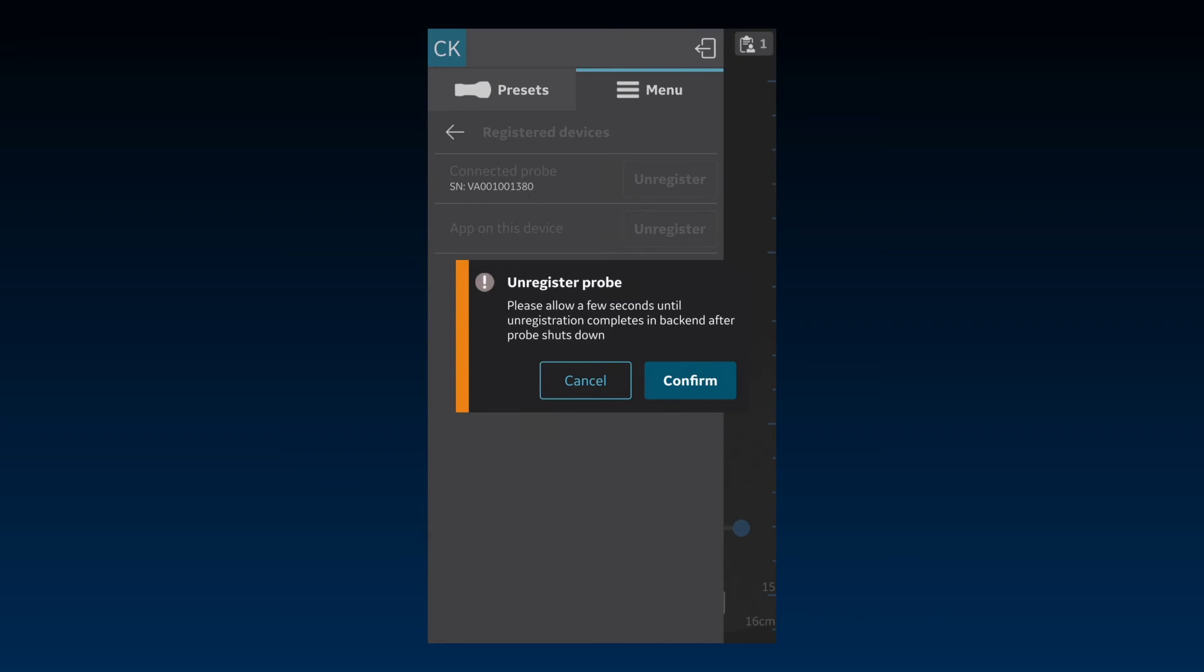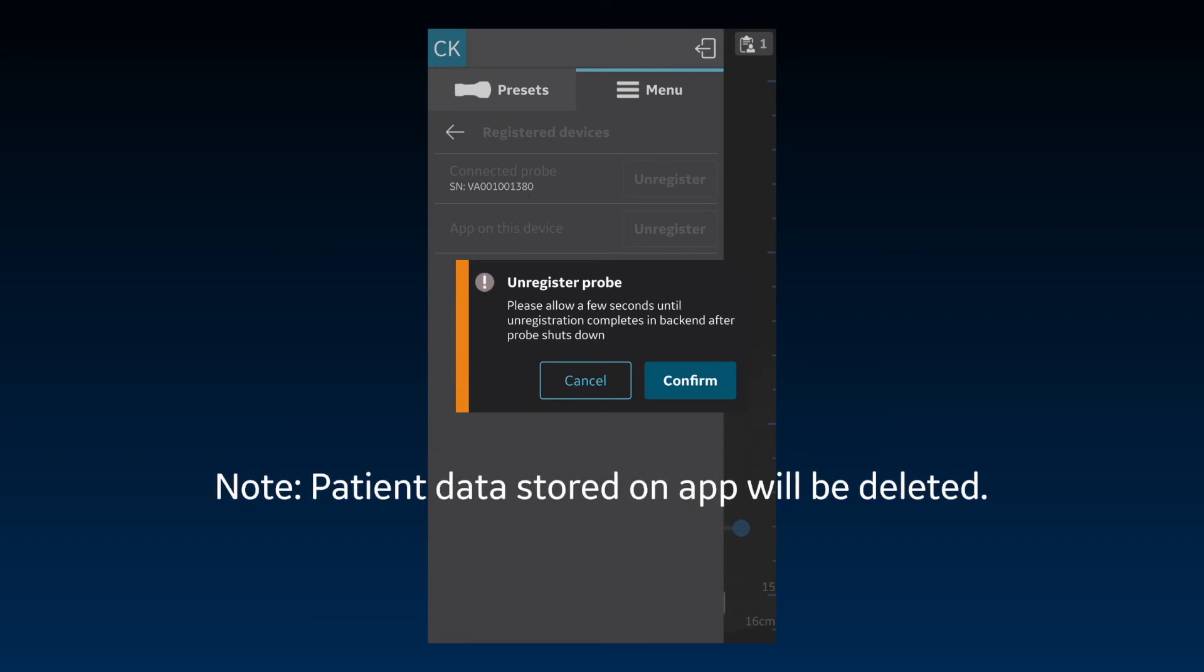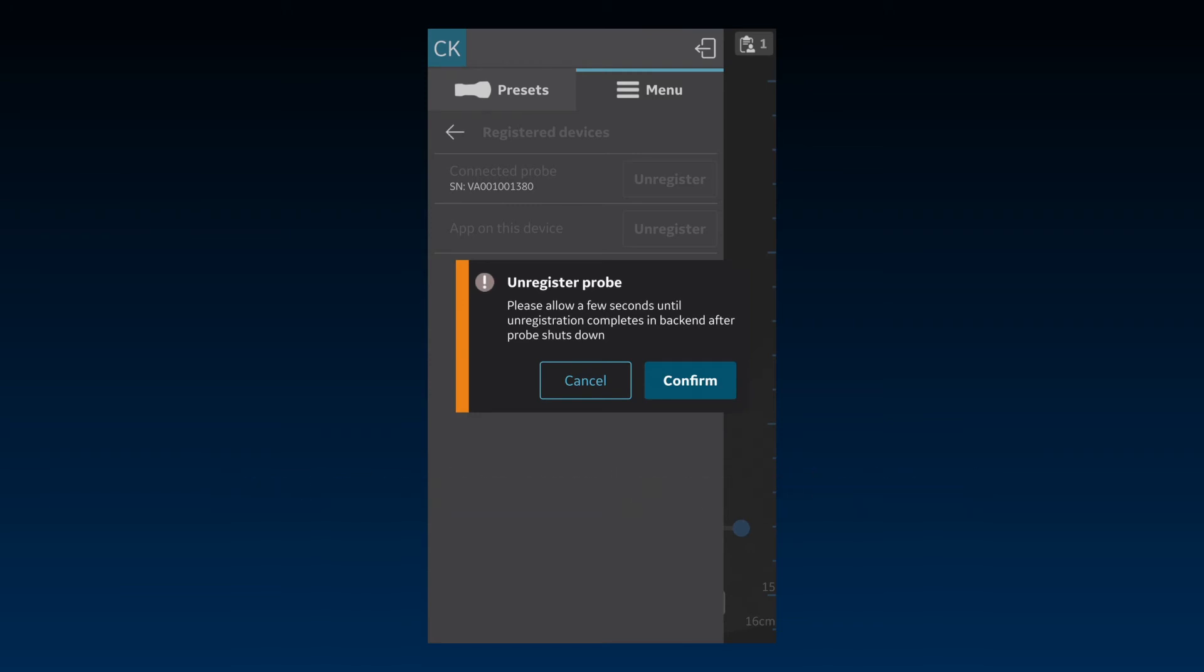As a security measure, patient data stored on the app will be deleted when the app is unregistered. You will need to confirm by selecting Erase before proceeding.